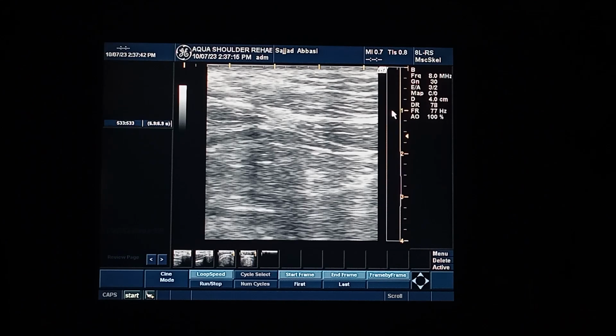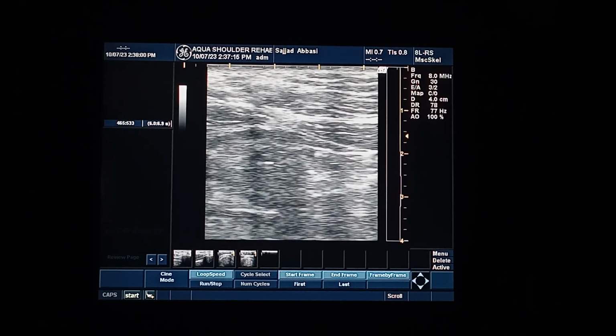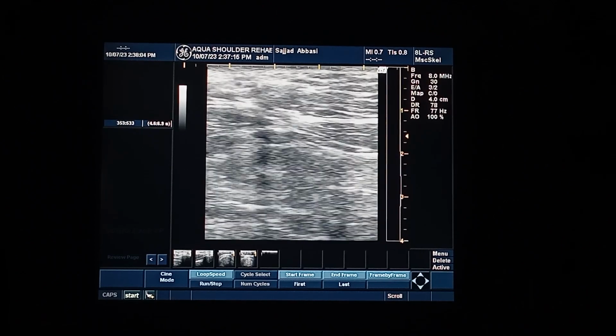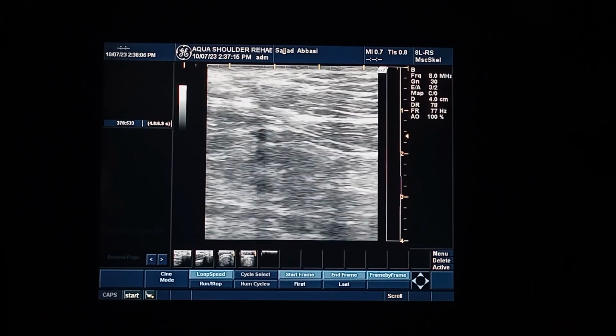1 centimeter. The anterior abdominal thickness or the fat is 1 centimeter, and below this 1 centimeter, you can see this fascia. And this is my right rectus abdominis. This is linea alba, this hyperechoic appearance, and this is the other rectus abdominis. And below this, you can see my intestines. So let's try to unwind it, and you might see the lower portion moving. When you see this movement, this is the intestine that is moving.